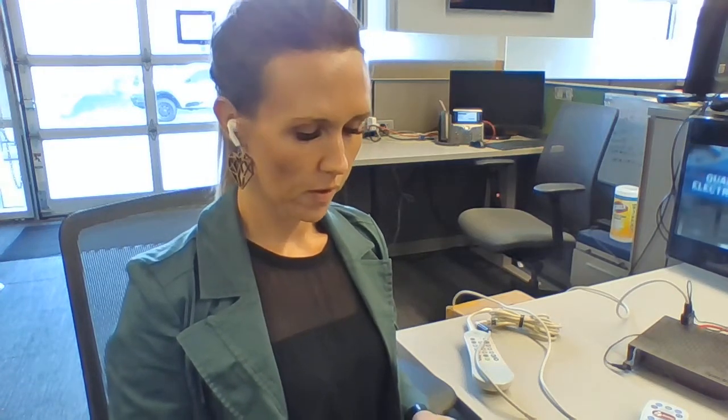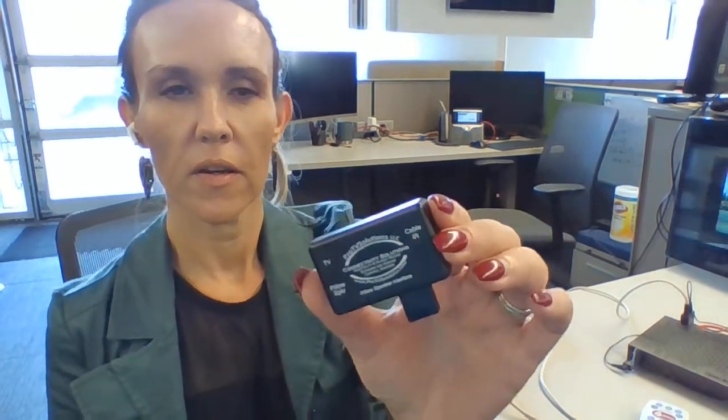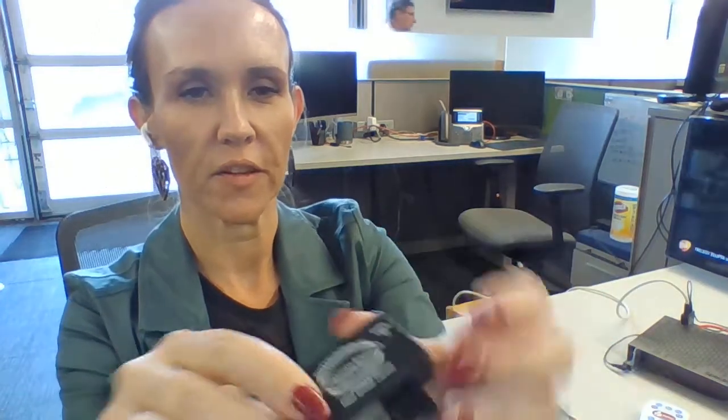Hi, my name is Tiffany and I'm going to go over the pillow speaker interface with you. This is the pillow speaker interface and as you can see there are connections for the TV, the pillow speaker, and then on the other side is for the cable IR.